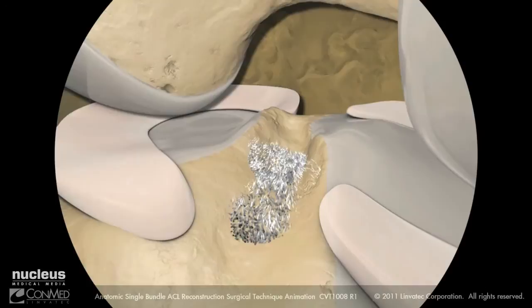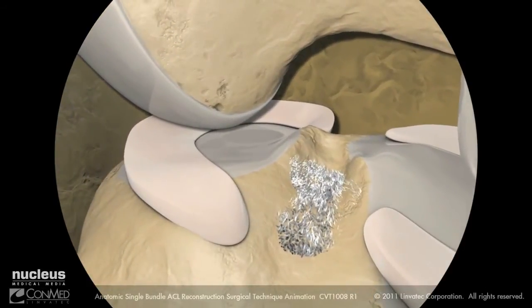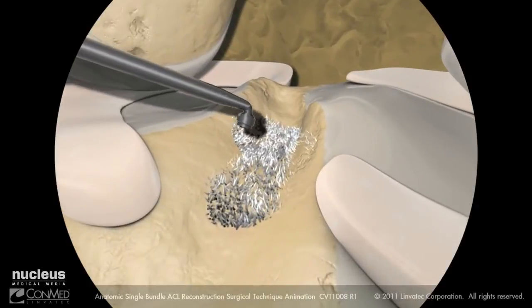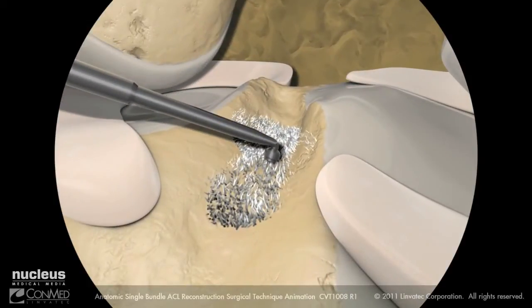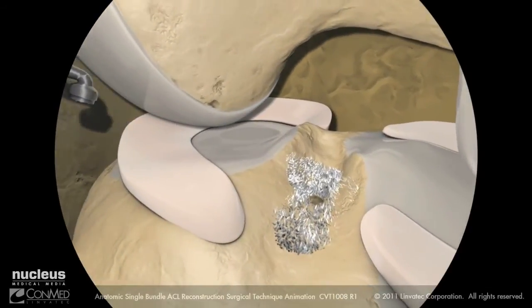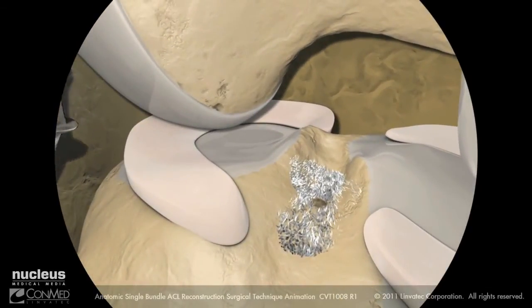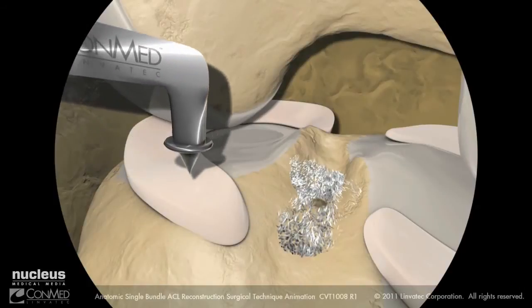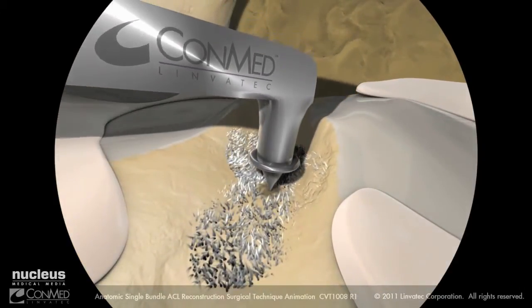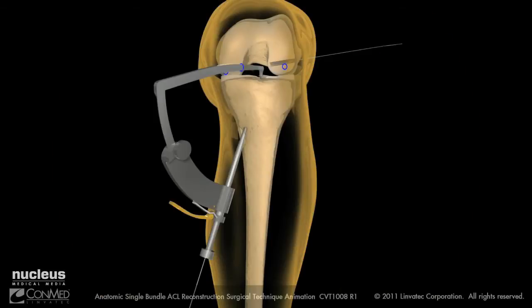Switch the arthroscope to the anterolateral portal. Insert the light wave ablader into the anteromedial portal to mark the center of the tibial ACL footprint. Set the angle of the pin ACL guide to 55 degrees. Insert the tip into the anteromedial portal, placing the tip of the guide into the center of the tibial ACL footprint. Then advance the external guide sleeve flush to the anterior tibial cortex.